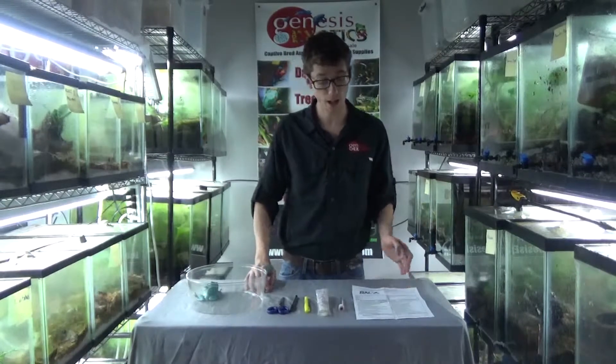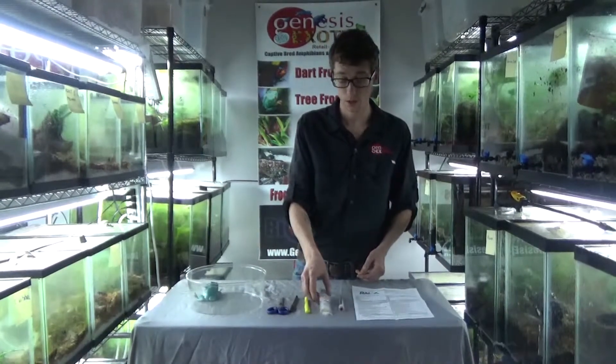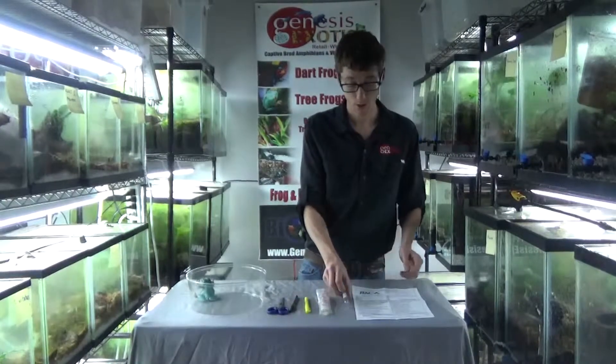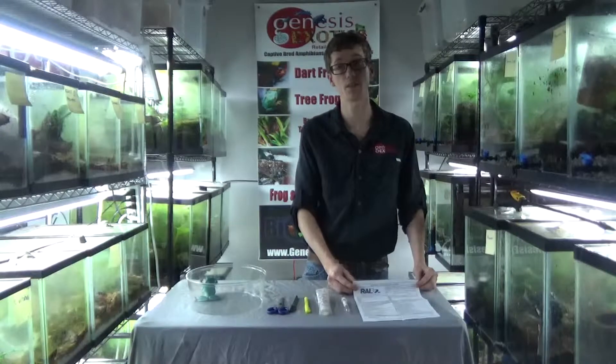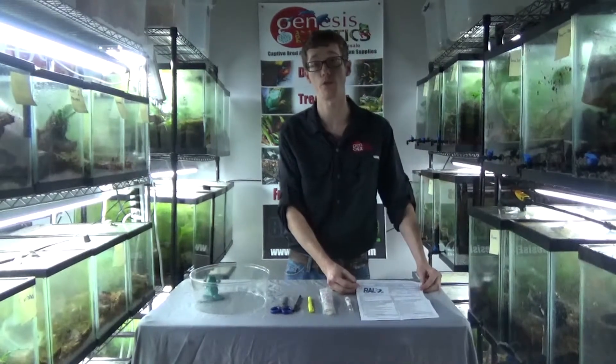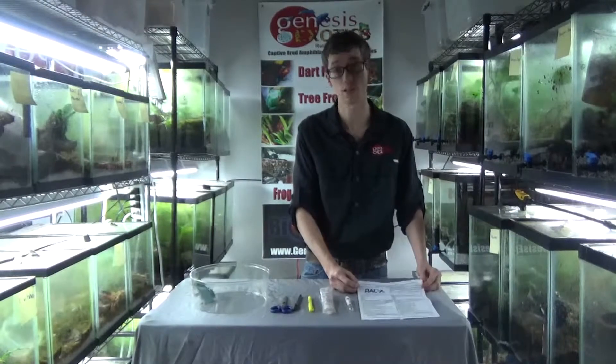As you can see here, I have the layout of the kit. I have a sterile culturette, a sterile tube, and your form to Research Associates Laboratory in Dallas, Texas, which we have found to be the most efficient and reliable source for testing your frogs for ranavirus and chytrid.